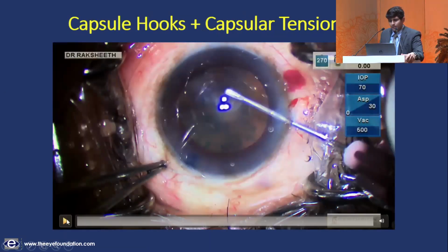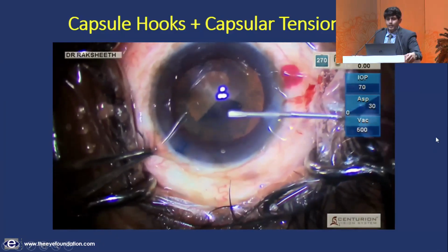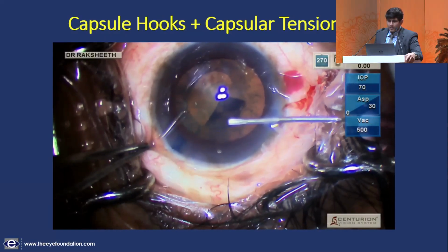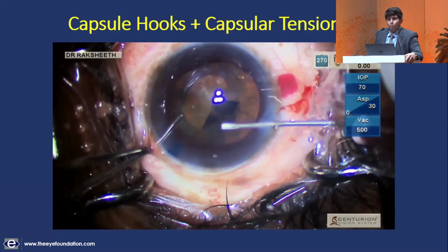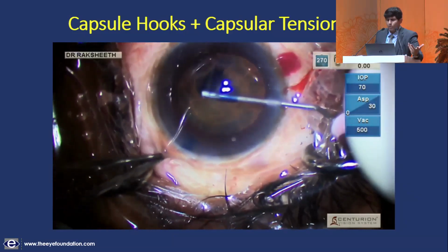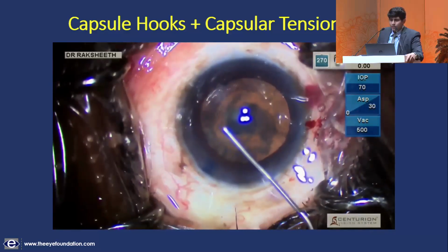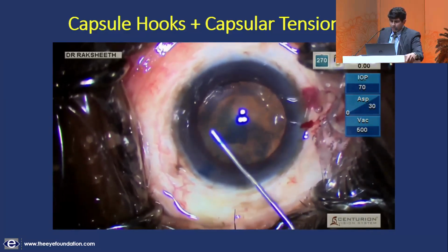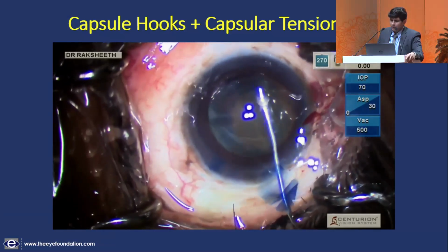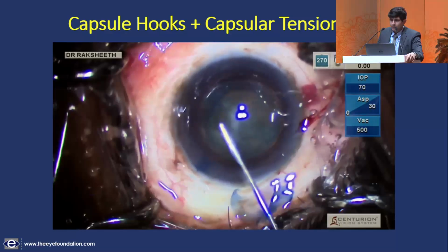This is another case here where the zonulopathy itself was recognized and acted upon at an earlier and probably the right phase of surgery. There is some amount of subtle movement of the cataractous lens while I attempt to complete and fashion the capsular rhexis, but this does not preclude the completion of a capsular rhexis of desired size. I go ahead and proceed with hydrodissection in a sweeping motion here, being a little bit gentle because this is a dense cataract. I'm not very confident giving a hydro, but you can see there is quite a bit of movement of this cataractous lens along with the bag complex.